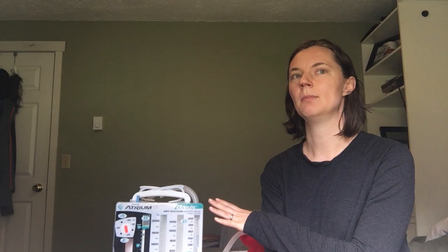Don't use CPAP. So these are the don'ts. Don't use CPAP or BiPAP with these patients unless you have a specific order from the thoracic team saying it's okay to do with the chest tube in. That positive pressure can cause there to be air leaks and keep the space open rather than seal closed like it should.